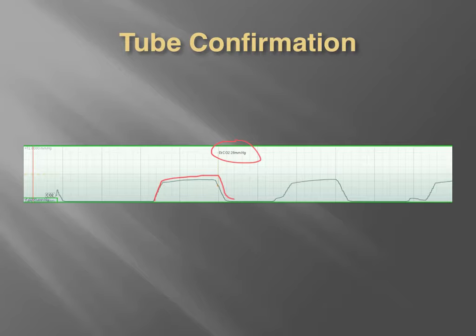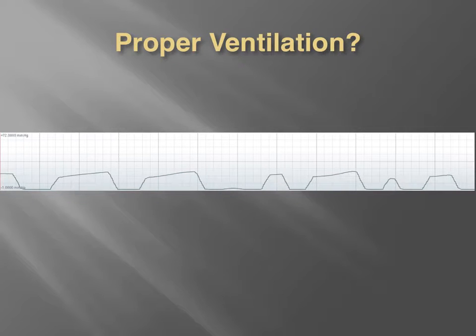Now if we go to the next slide, we can see that this is a patient that was intubated, and this was a ROSC patient where we had a very good outcome long-term also with this patient. However, you can see that with ventilating this patient, someone was getting a little too excited, and we were using a bag valve mask.